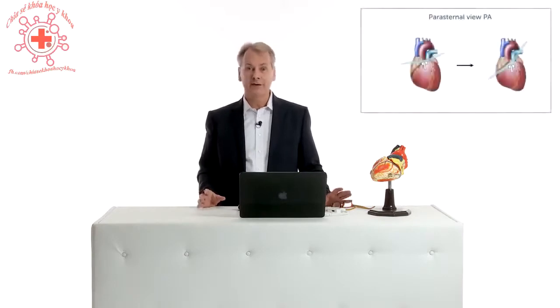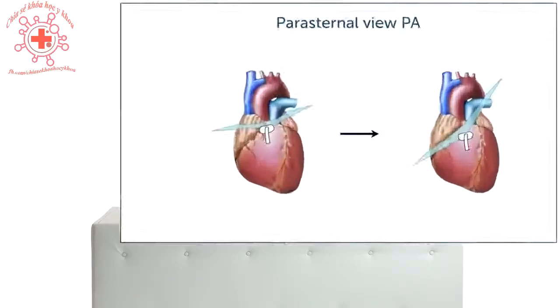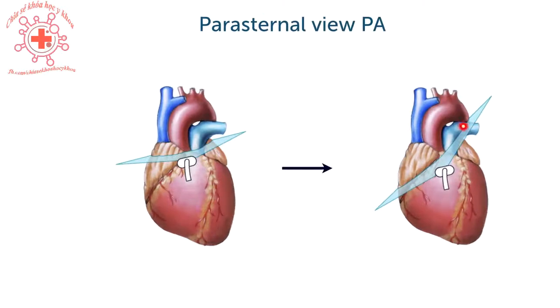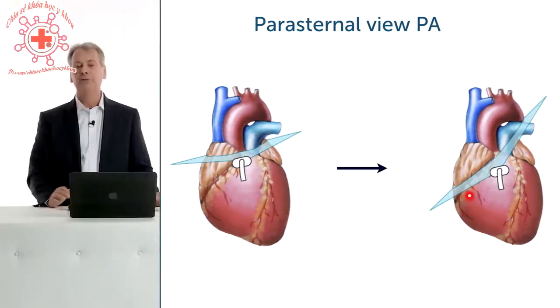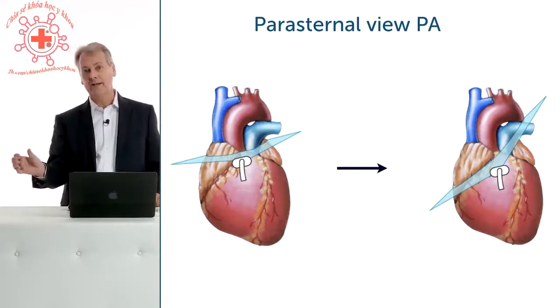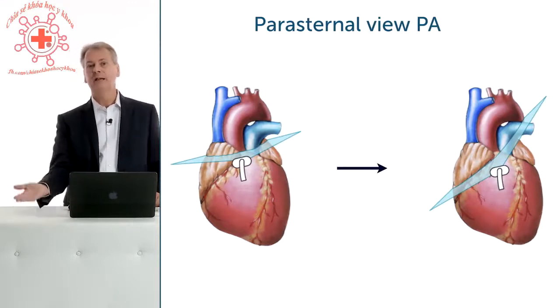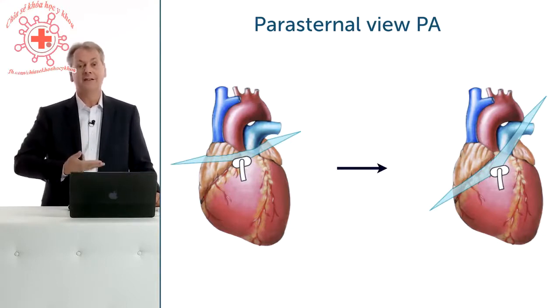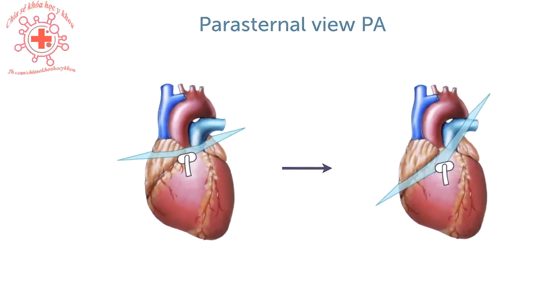From the parasternal short axis view, you just have to perform a small maneuver to get a better view of the pulmonic valve. So this is the modified view of the pulmonary artery and the pulmonic valve. You see that the orientation here is a little bit more oblique. You're performing a maneuver where you rotate the transducer clockwise and tilt a little bit to get more shallow so that you're closer to the pulmonic artery, which is actually closer to the chest of the patient.